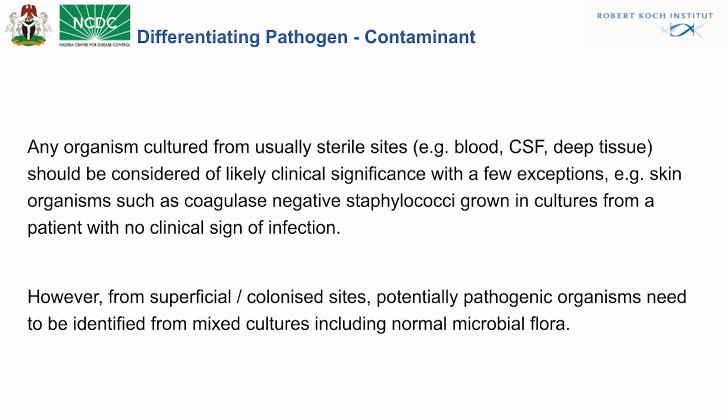It is also pertinent to know that any organism cultured from sterile sites, such as blood, CSF, or deep tissues, is usually considered of clinical significance, with few exceptions, such as skin organisms, such as coagulase negative staphylococcus species, grown in culture from a patient with no clinical sign of infection. However, from superficial colonized sites, potentially pathogenic organisms need to be identified from mixed cultures and excluded from normal microbial flora.